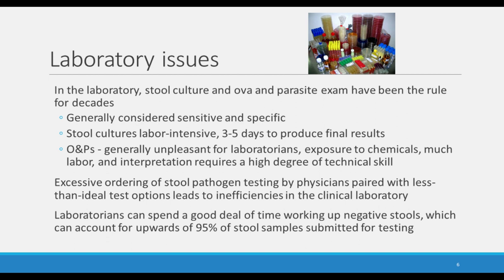You can also have excessive ordering patterns of stool pathogens testing by physicians paired with less than ideal test options. And this can lead to problems in the clinical laboratory where you're just getting lots of tests and duplicate tests and repeat tests for all different kinds of pathogens. And unfortunately, laboratorians can spend a good deal of time working up negative stools, which can account upwards of 95% of the stool samples submitted for testing.